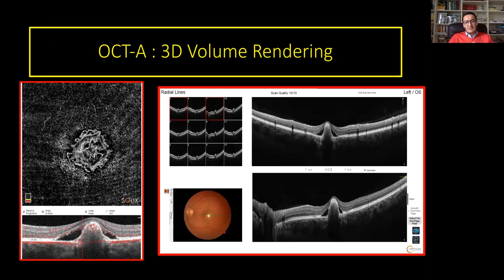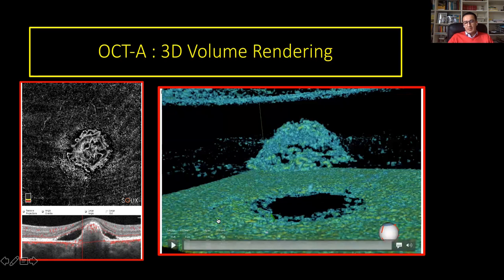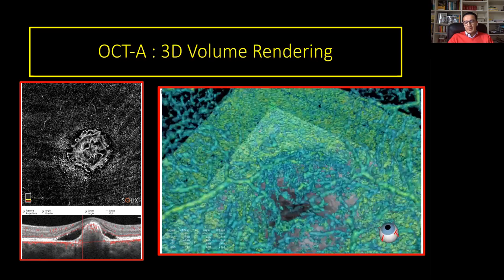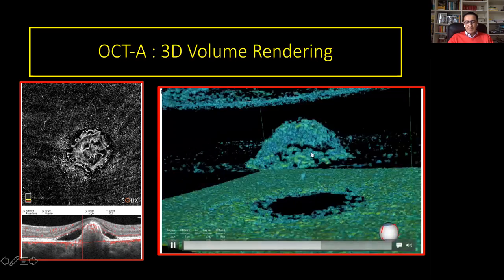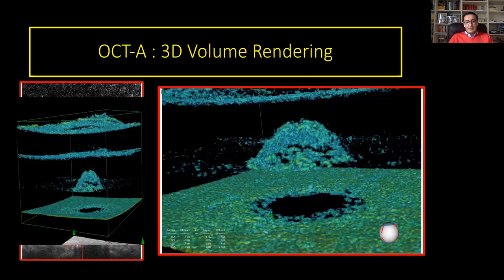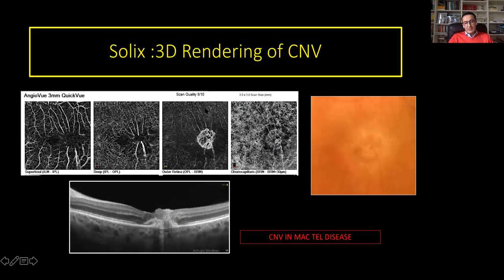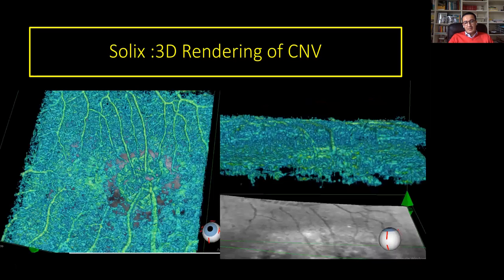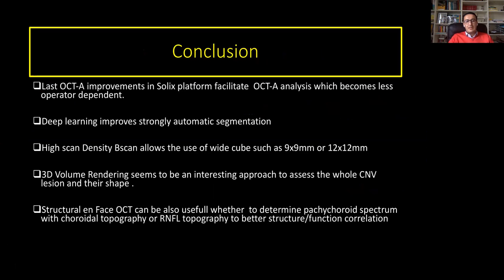As you know, in OCT angiography it is sometimes difficult to see the whole lesion and you have to perform several segmentations to analyze the full lesion. Now, with four consecutive volume scans of 3x3, you can have a 3D rendering of the lesion to appreciate — in this case — the dome shape of the CNV, explaining the shape of this characteristic lesion in Best disease. Another case of CNV complicated by MacTel shows the abnormal connection and anastomosis between superficial capillaries and intraretinal neovascularization.